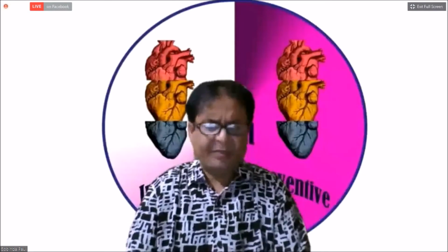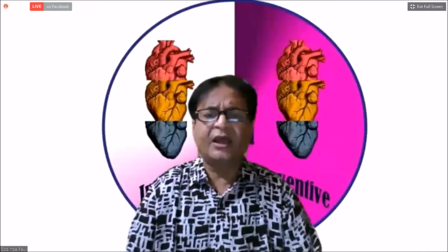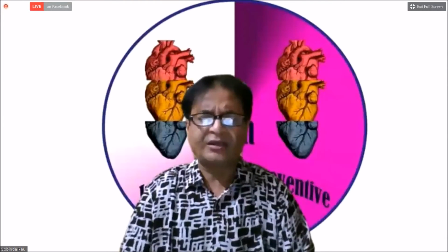He also wants to know, can hammocking of PML be diagnostic of MVP? Yes, hammocking, but not only M-mode echo, it also correlates with the 2D image, the prolapsing from the mitral annular plane, usually 2 millimeter or more towards the left atrium during systole.